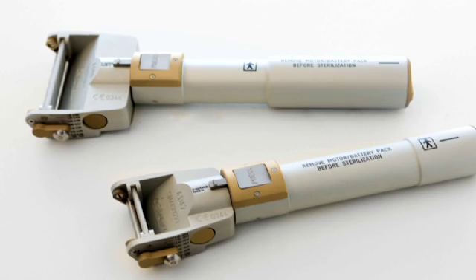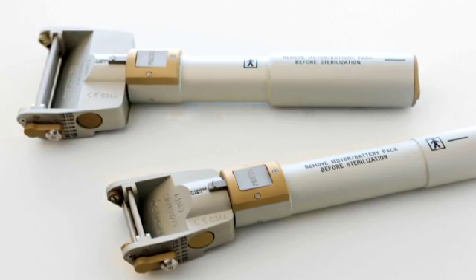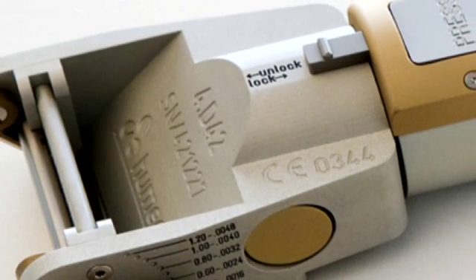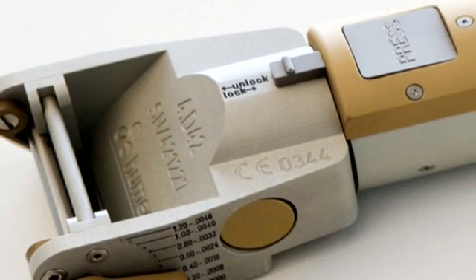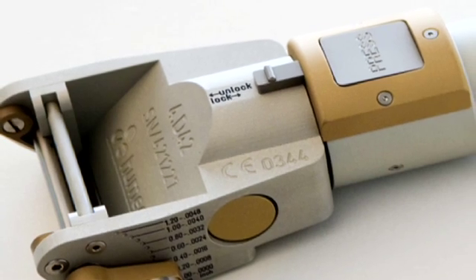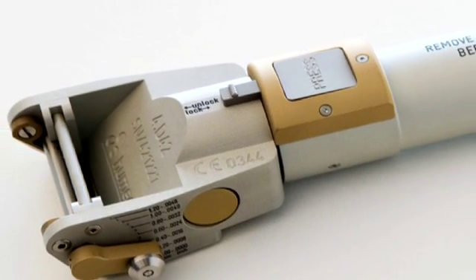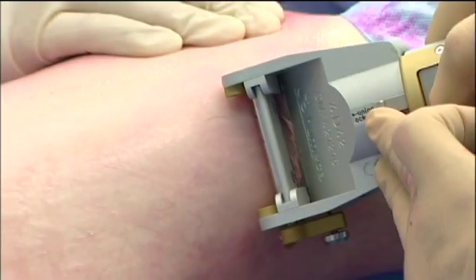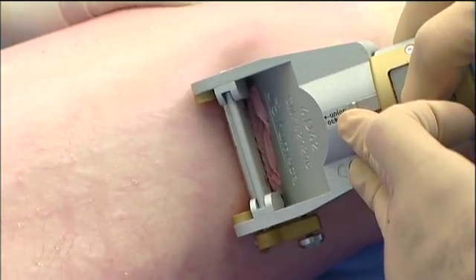Humica designed two cordless battery-driven dermatomes, the D42 and the D80. The D42 is a small and lightweight battery-operated dermatome. Its maneuverability makes it an excellent tool in pediatric and general plastic surgery. It's very suitable for harvesting grafts from curved surfaces and also for primary excision.